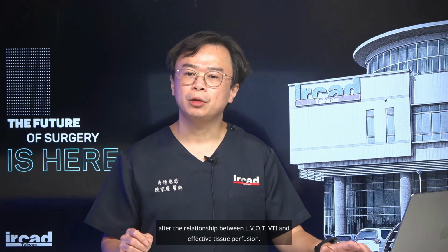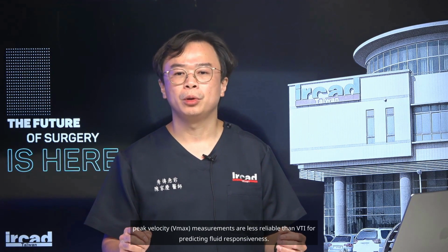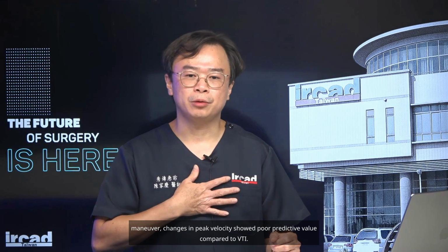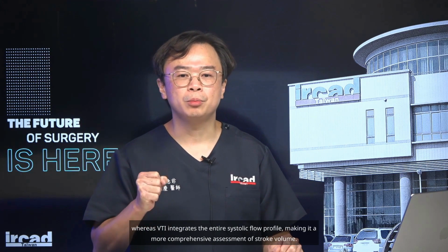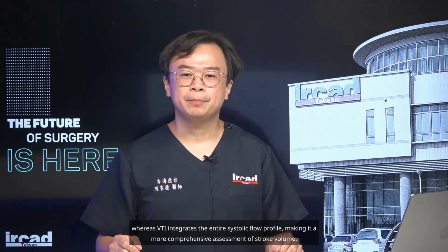8. Reliance on peak velocity instead of VTI. Research demonstrates that peak velocity, Vmax, measurements are less reliable than VTI for predicting fluid responsiveness. The study by Ma et al. in 2021 found that during the Trendelenburg maneuver, changes in peak velocity showed poor predictive value compared to VTI. Peak velocity measures only a single point in the cardiac cycle, whereas VTI integrates the entire systolic flow profile, making it a more comprehensive assessment of stroke volume.